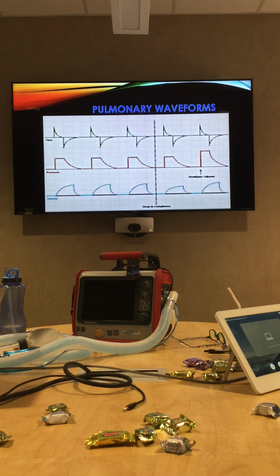What they found is when those compliance changes happen, you'd have a nurse that goes in a room and gives a sedative to a patient that might be extremely active. So all of a sudden their CO2 drops or increases, and we go in and make some volume or rate changes. So now we're already affecting the lung. Before long, they're going from a 500 tidal volume up to 1,000, so the recruitment part of that lung is now extremely damaged.